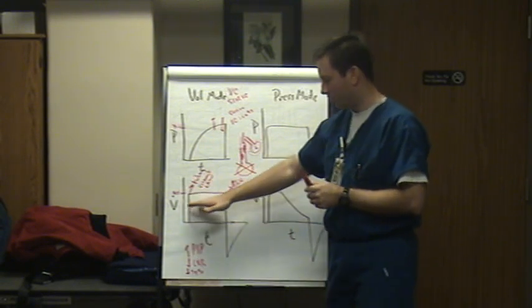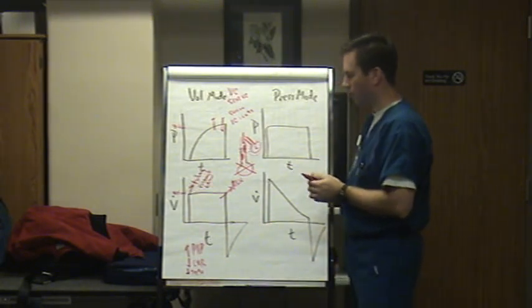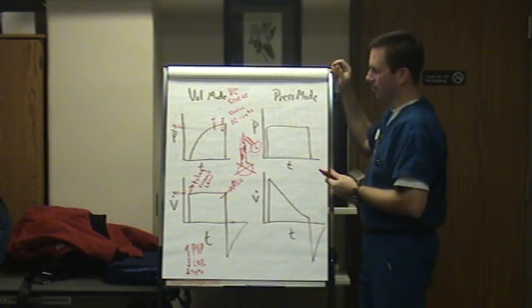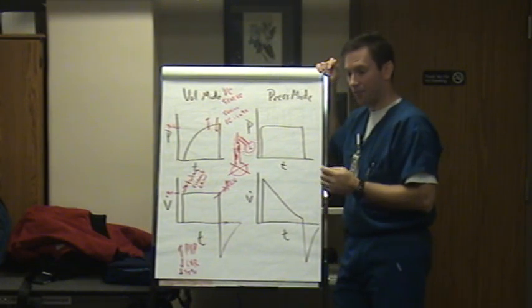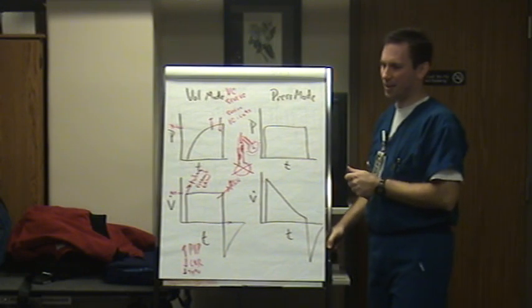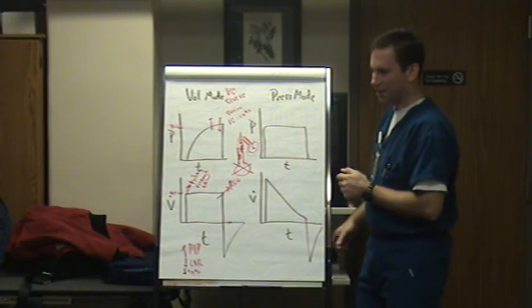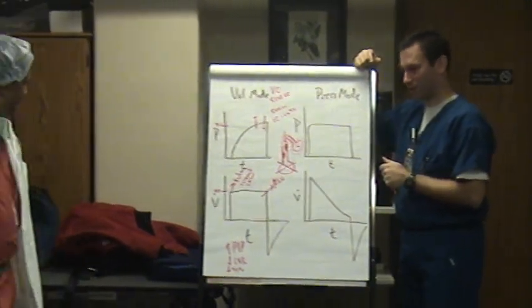Very good. The flow is very turbulent. It's forceful. See how it just shoots in, stays the same speed? So it's too much flow for this patient. And so at this point, if the nurse calls you and says the peaks are high, we need to do something, the therapist is usually going to suggest that we turn them over to a pressure control mode.